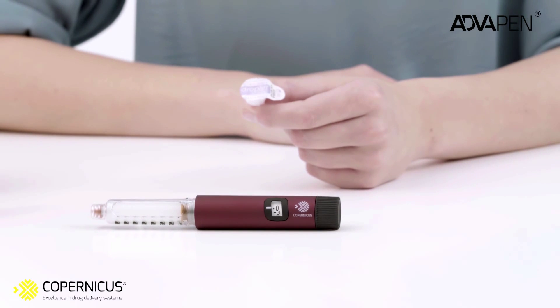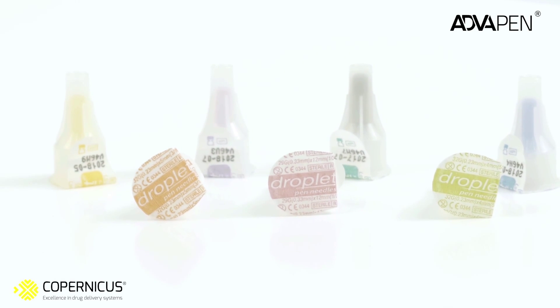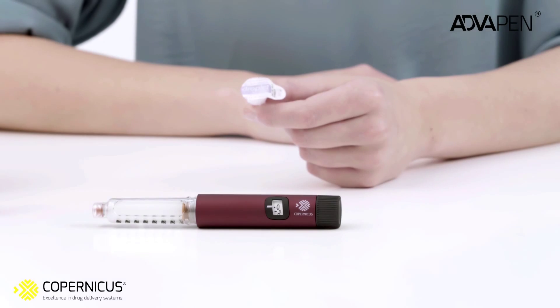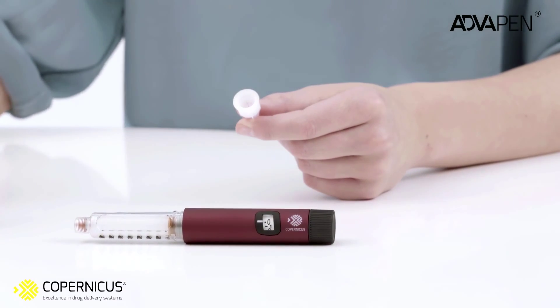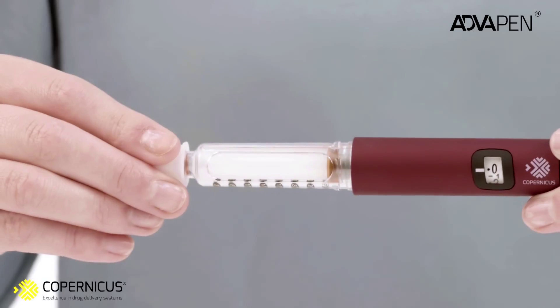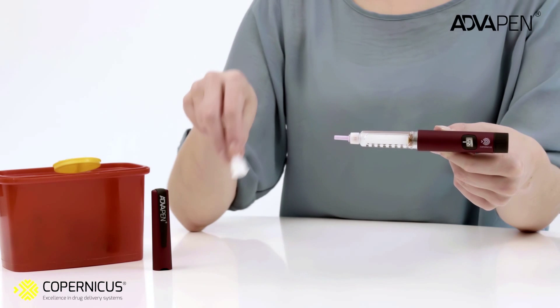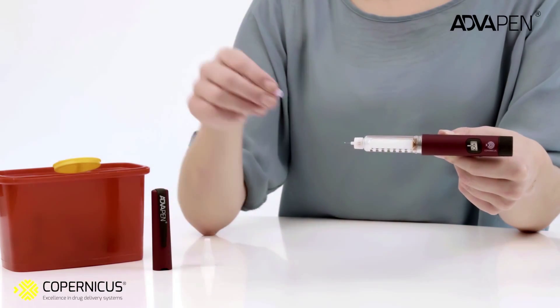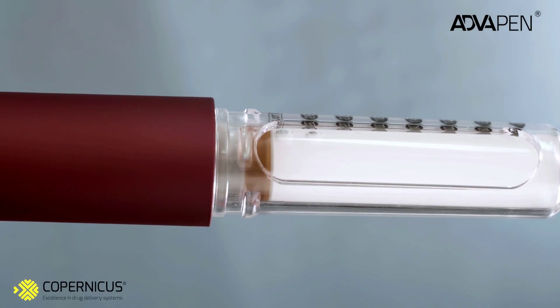Now your pen is ready for needle attachment. There are different sizes of needle — the length and diameter that suit you best shall be determined during your conversation with the doctor. To attach the needle, rip off the paper tab from the outer needle shield and attach it to the cartridge holder by turning it clockwise. Remove the outer needle shield — remember to keep it in order to remove the needle after injection. Then remove and dispose of the inner needle shield.